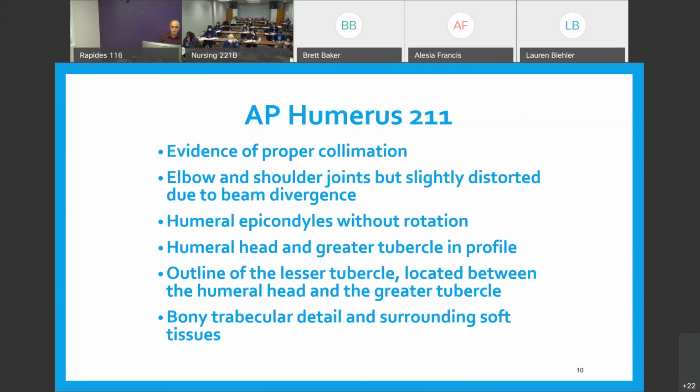CR. That's why the book keeps talking about the CR. Central part of the beam. Those are the only x-rays that are traveling in a straight line. Those will keep your joint spaces what? Open. So the further you get away from the central part of the beam, they start at an angle. The angle causes what? Joint spaces to close, right?